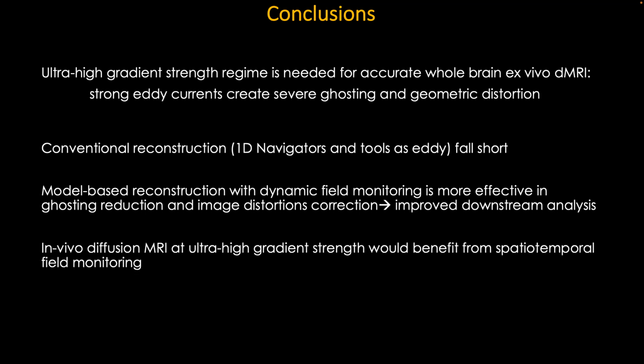We also expect that this technique can be translated to in vivo diffusion MRI.